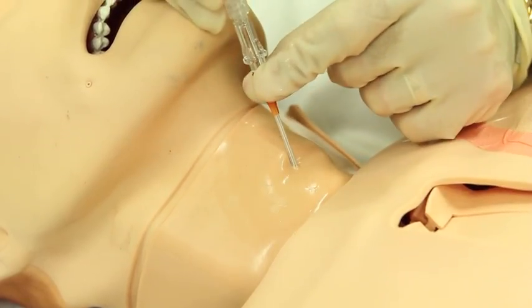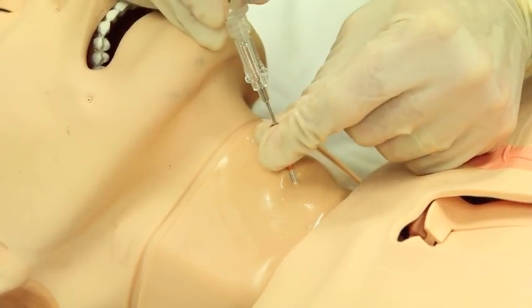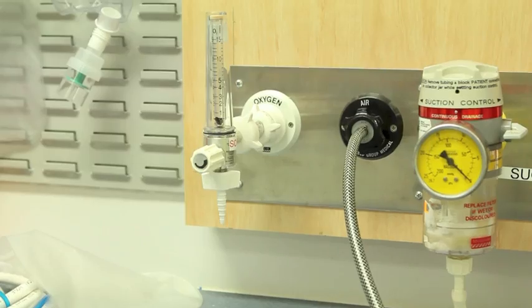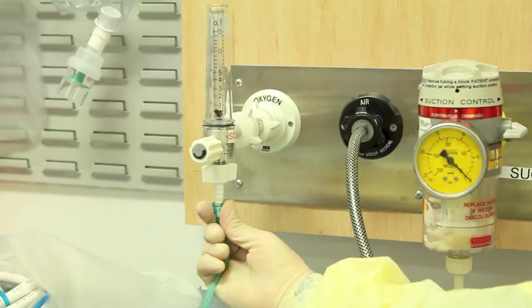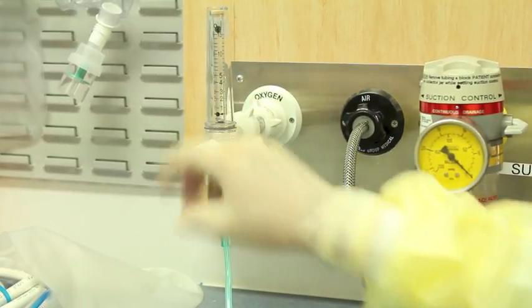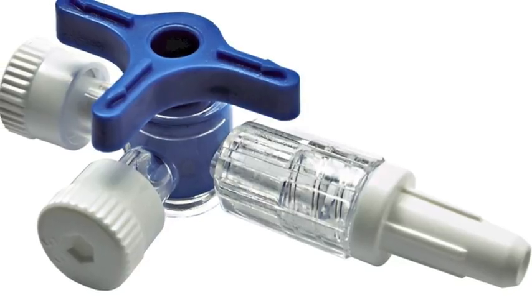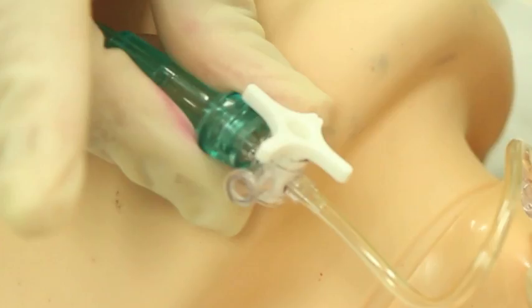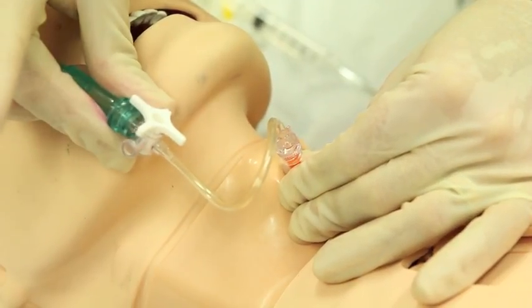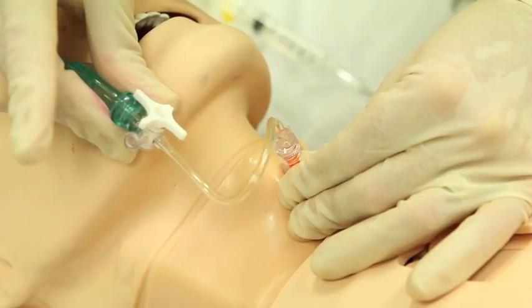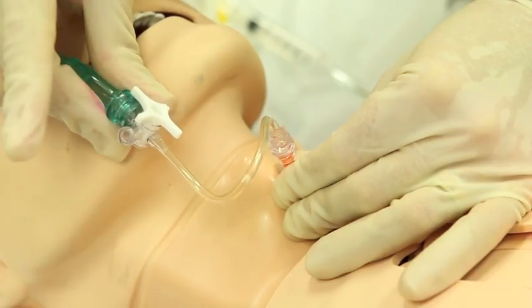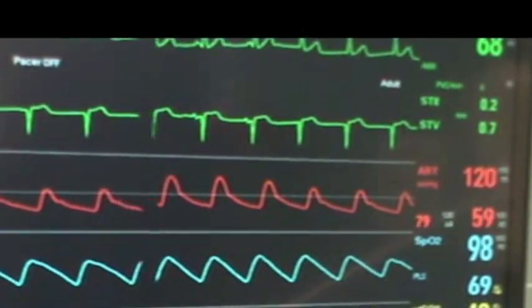Stabilising the needle, the cannula can then be advanced into the airway. The three-way tap is secured, the oxygen tubing attached to a flow meter, and the oxygen increased to 15 litres per minute. The three-way tap is positioned to open on all sides. In this position, the path of least resistance is through the open port. Insufflation of gas can occur by occluding this port for one second, followed by a period to allow expiration to occur, usually around three to four seconds. Repeating this cycle can maintain oxygenation for up to 20 minutes in some cases.